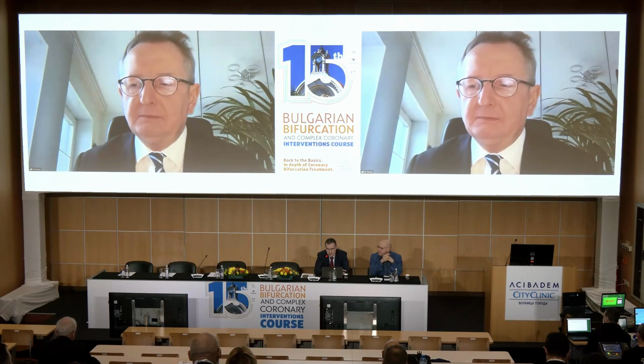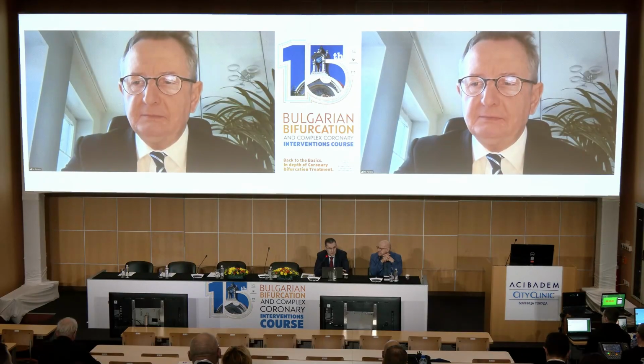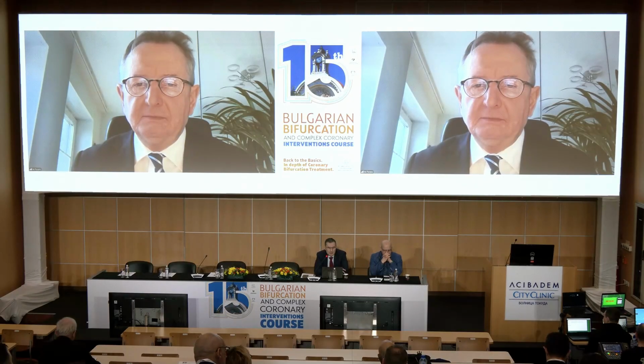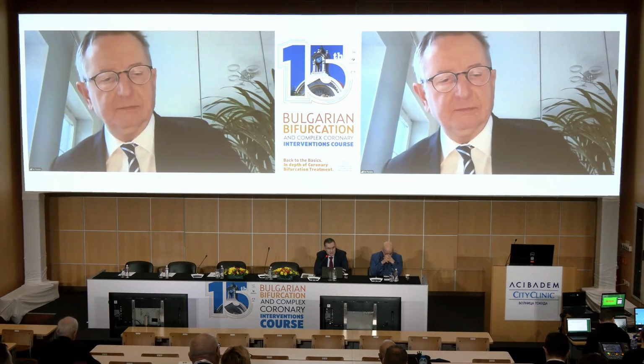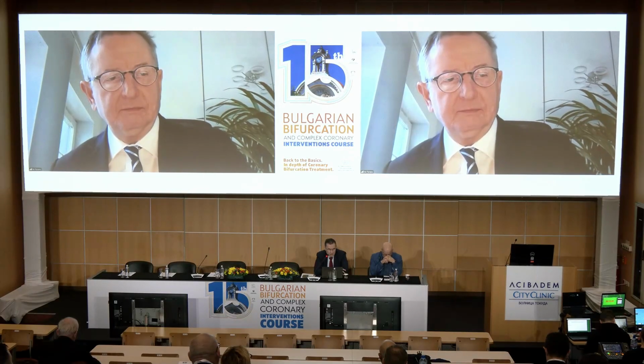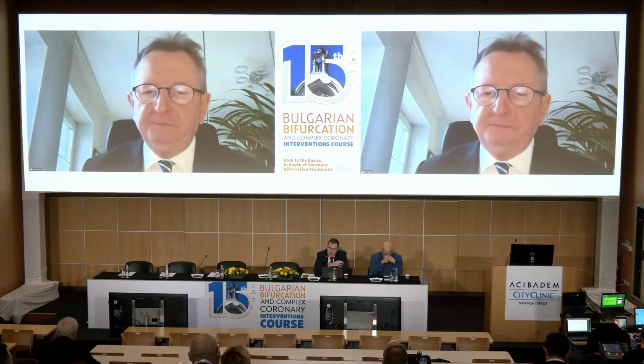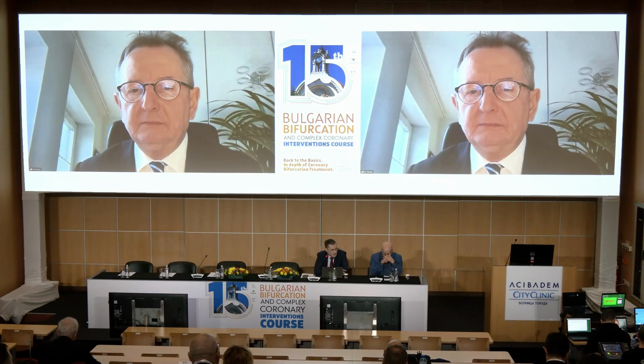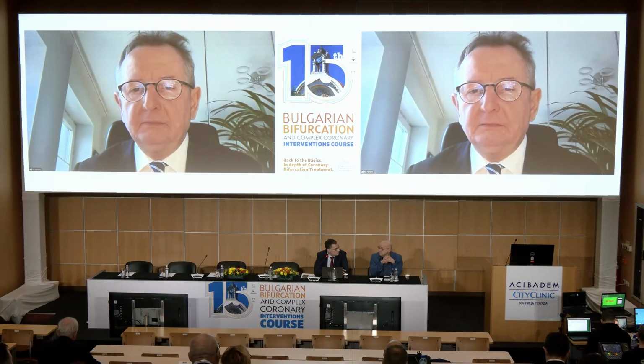Actually, this burr stuck, I think, is mainly a problem of training of the operator from some cases which I saw, but mainly this is an issue regarding the competition from orbital atherectomy, and this is another alternative if there is a burr which is capable of making an ablation front and back. This is just a comment.